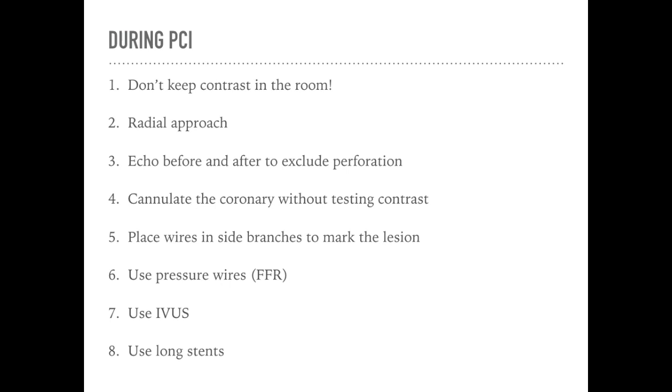Use of IVUS for assessment of the vessel diameter, of the lesion length, of the plaque characteristics, and the success of PCI is essential. Use of pressure wires to judge the severity of the lesion and to judge the hemodynamic impact of PCI is also very helpful.